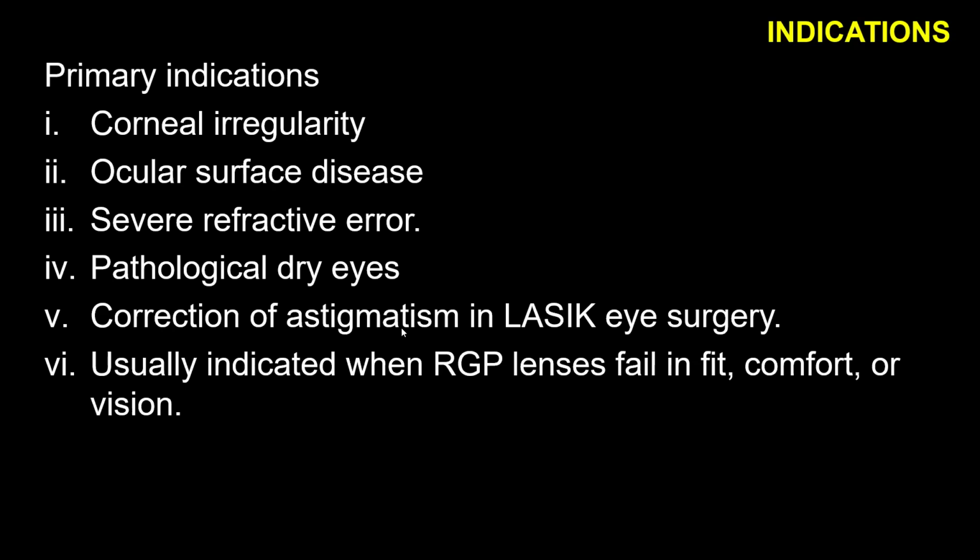So, in that case, I mentioned that in the case of that extreme case of dry eye, your best option or best bet might just be scleral contact lenses because it will help to lubricate and hydrate the eyes as long as the patient can stay for the day without having need to apply topical eye drops.